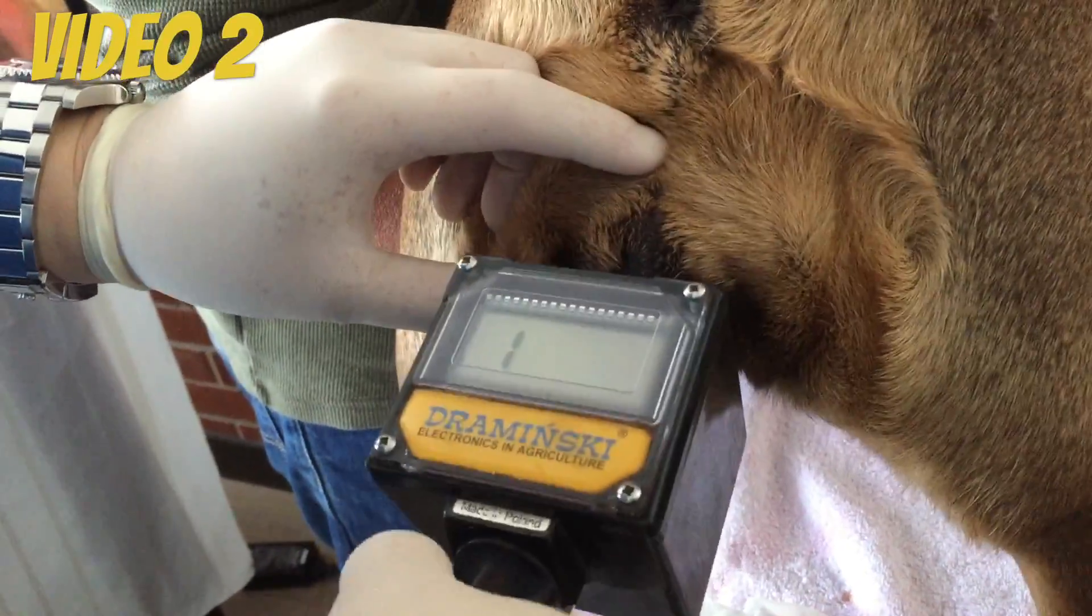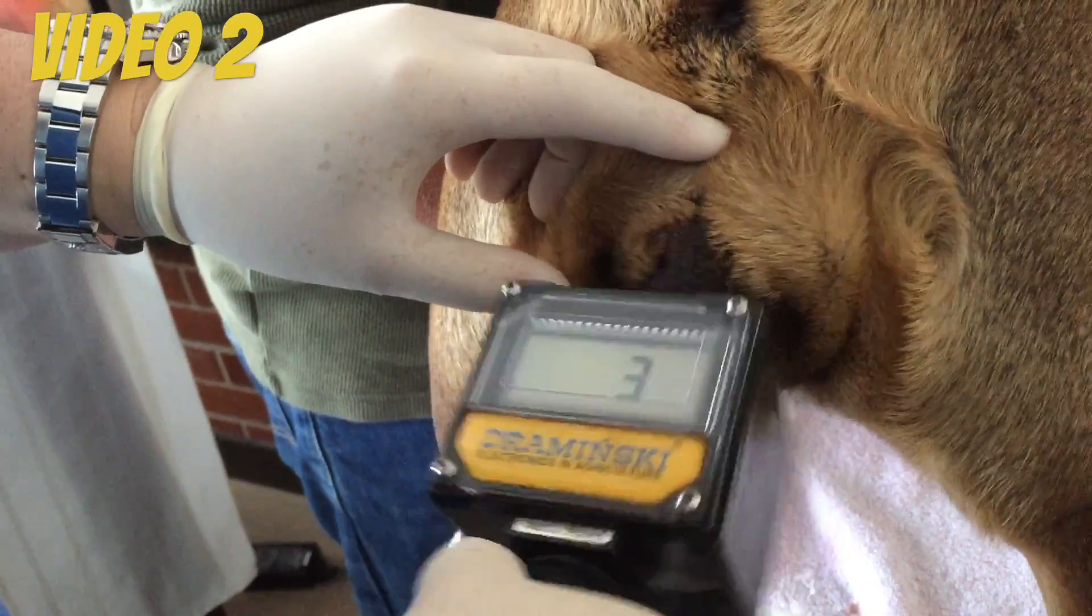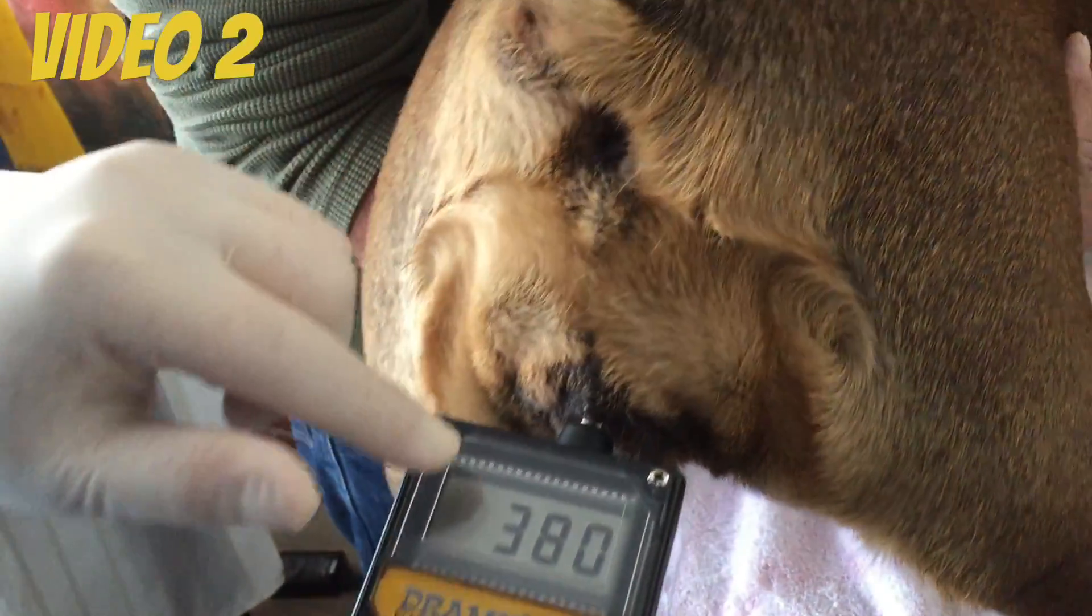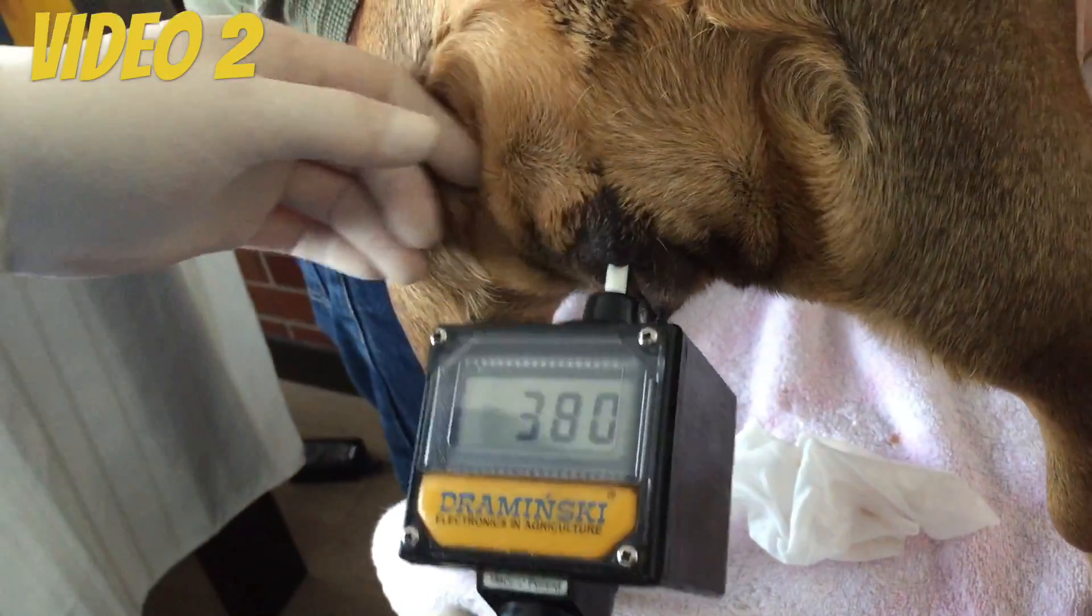One, two, three. 380. So yesterday she was at 970 and then today she's at 380. So she dropped.